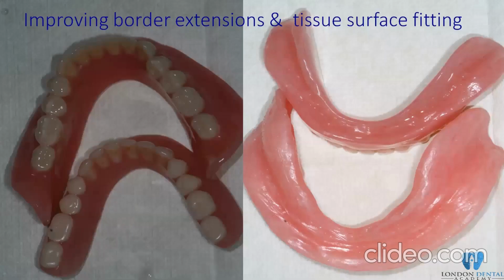Now, let's presume that I finished my denture and I'm in the process of finishing the bite, finishing the try-in, and fitting the denture. I did this example, and this is the edentulous surface or tissue surface of the new denture compared to the old denture, and this is the occlusal surface of the new denture compared to the old denture. Clearly, as you can see, there is a big difference, and most of you will agree that it has to do with the extension.